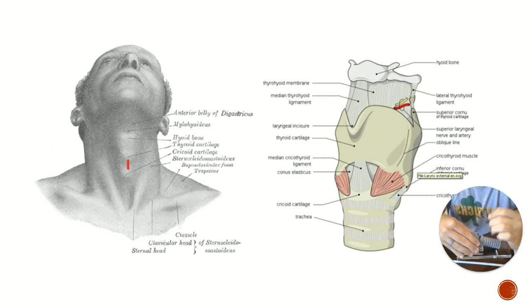Remember, they could be breathing, could be not breathing, so you have to stabilize yourself. You're going to take this, your weapon. This is your scalpel. It looks like a pen, but it's a scalpel. Stabilize the area. Feel with your non-dominant finger. You feel your thyroid cartilage. You feel your cricoid cartilage. You feel that small dip in there.